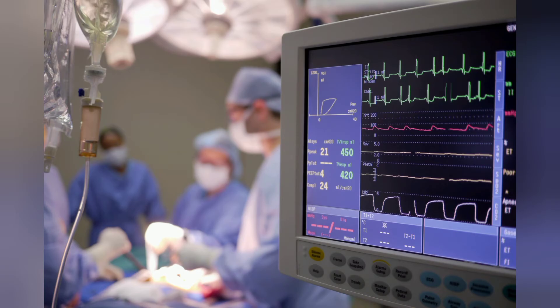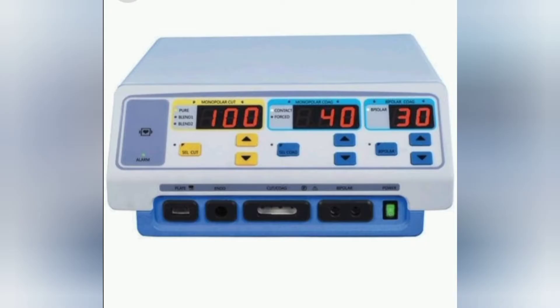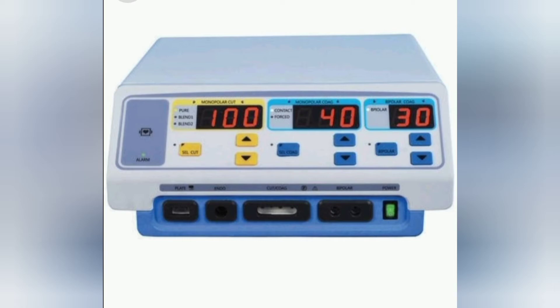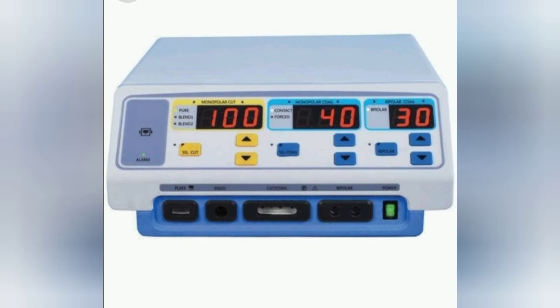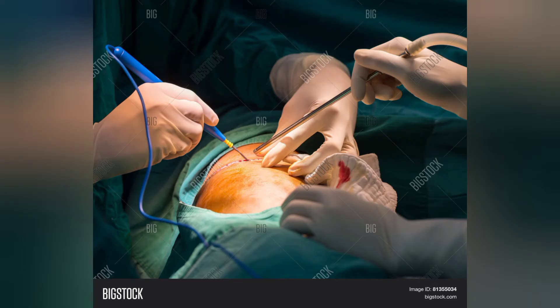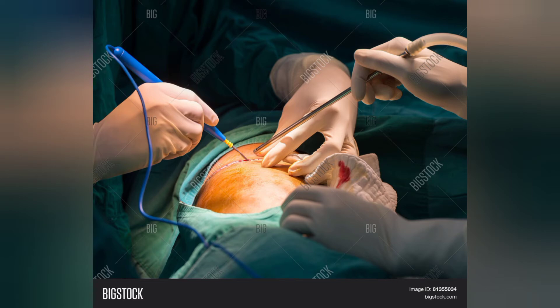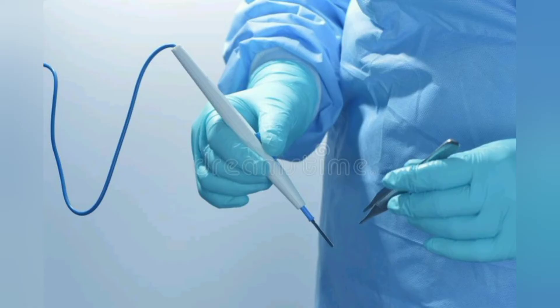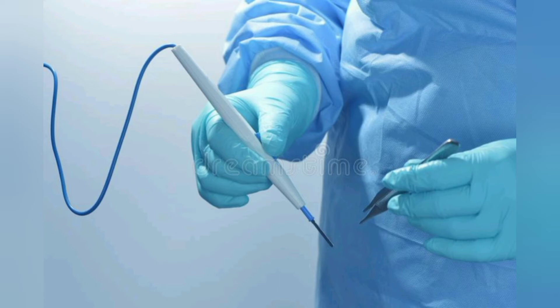The next equipment is the cautery machine, also called the electrosurgical machine. The surgeon uses this machine for cutting and coagulation purposes during surgery. Use of this machine really saves surgery time and also decreases blood loss during surgery. This equipment runs on electricity, hence it is called an electrosurgical machine. Safety measures are provided with the machine to eliminate the electrical current effect on patients.